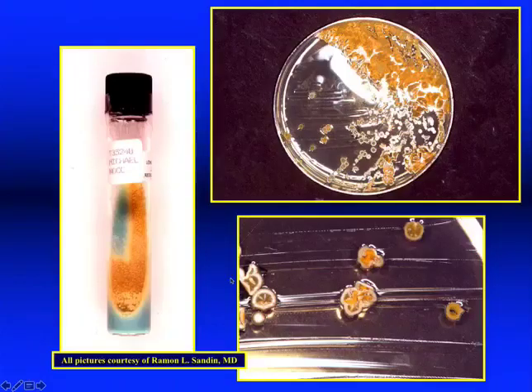Nocardia is not finicky. We don't have a nocardia medium. There it is growing on the Lowenstein-Jensen medium for mycobacteria, the green one. And this is the translucent one for fungi, the Sabouraud. And it grows as very gritty, yellow to orange, very beautiful colonies that have body and will resist you with a wooden applicator.